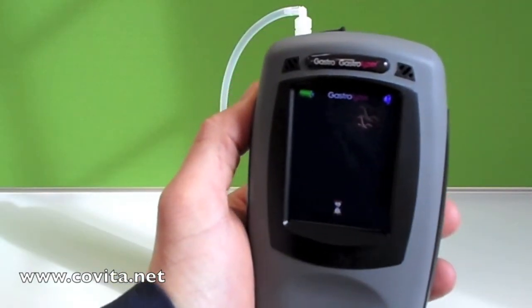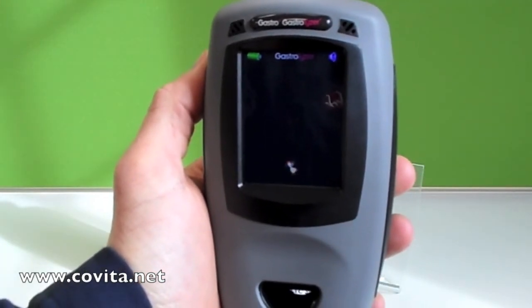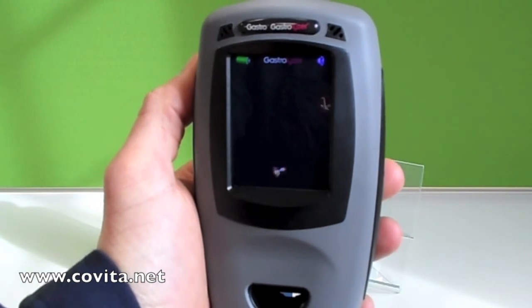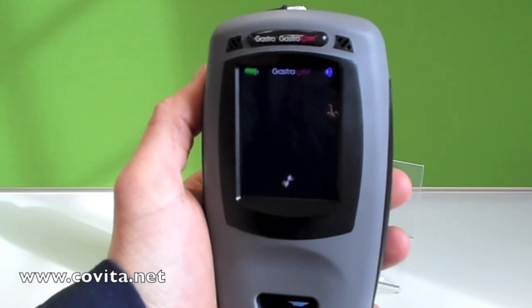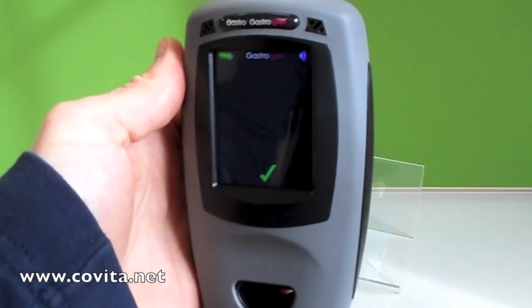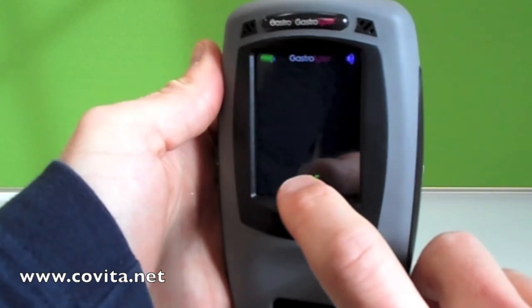The first step to calibration is zeroing. Touch the zero scale and a rotating hourglass will appear. Once the hourglass disappears and you receive a check mark, we are ready to continue. After touching the check mark, we will be taken back to the calibration screen.